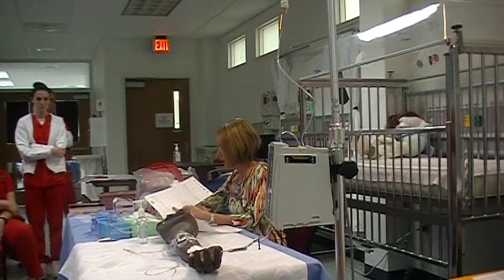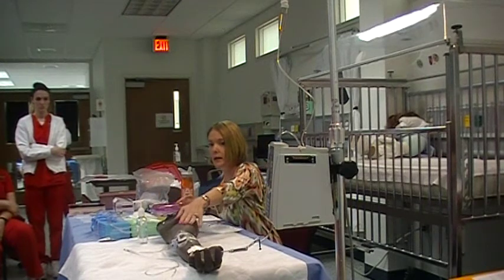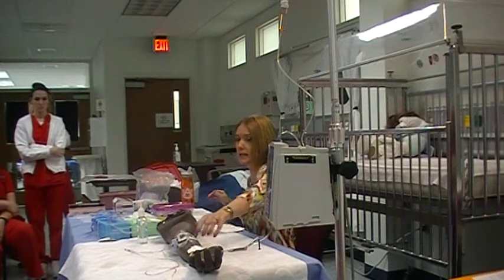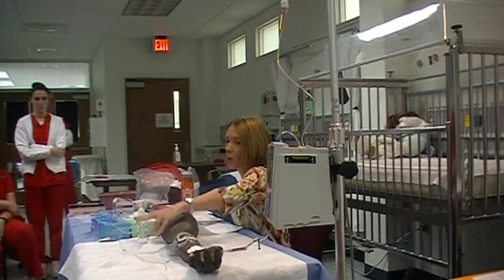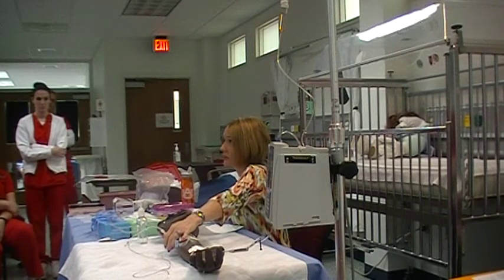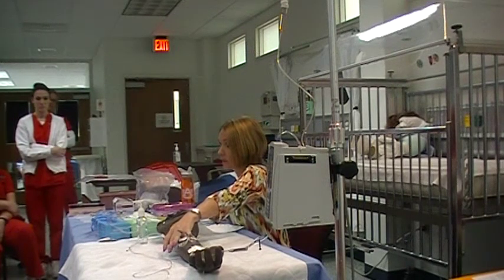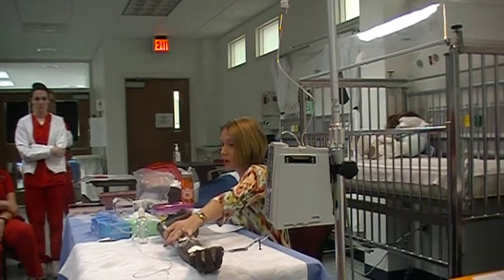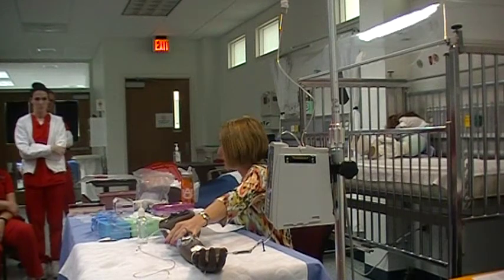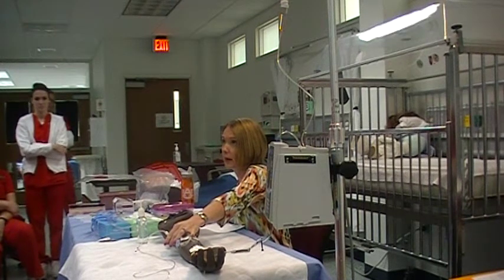Verify and verbalize compatibility. Now, I will either have it set up the way it is here, where you are already connected to a line, an existing line, or I may have it just saline locked for you, but that will be the only 2 ways you'll see it, either hooked up completely or in a saline lock form. Now, it's going to be your job, if you have it hooked up to an IV bag, to confirm whether or not Lasix is compatible with what I have hanging.